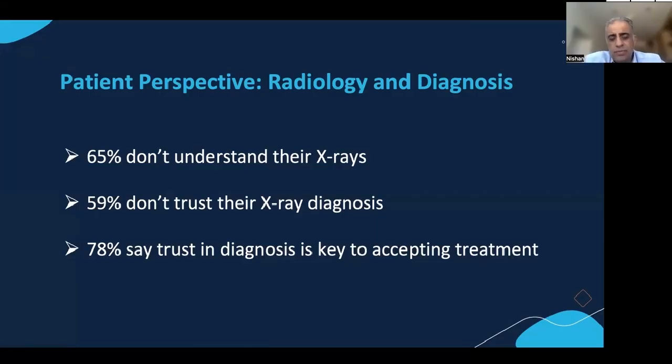So, you know, you build that trust up with the patient over a period of time, but use adjuncts. And in the past, we've been using X-rays, and then you couple that with intraoral cameras. And then now we're using intraoral scanners with NIRI technology, so near infrared technology. So that helps show patients what's going on. With the AI added to this, it's just going to increase that level of trust. And you're using every single tool available to you to explain to patients what is going on in their mouths.